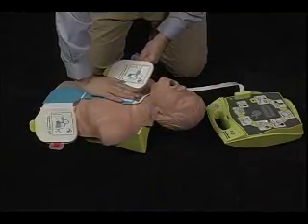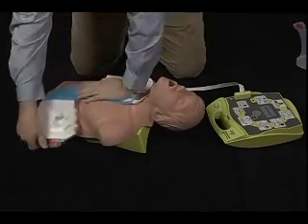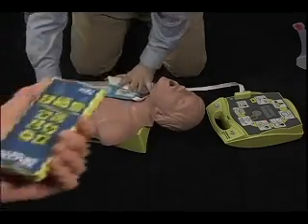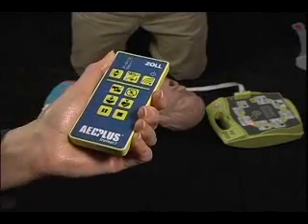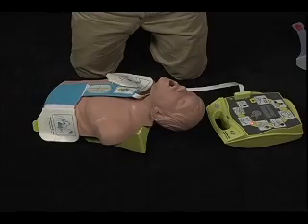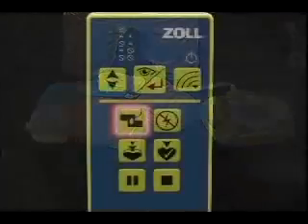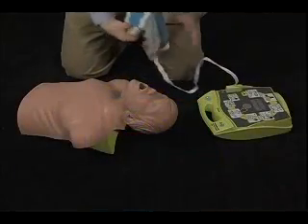In all scenarios, when the Trainer 2 unit says, Attach defib pads to patient's bare chest, it will keep repeating this prompt until the pads button is pushed once to simulate pads attachment and heart rhythm detection. The pads button can also be used to indicate that a student has attached pads quickly, which will cause a jump to analysis.